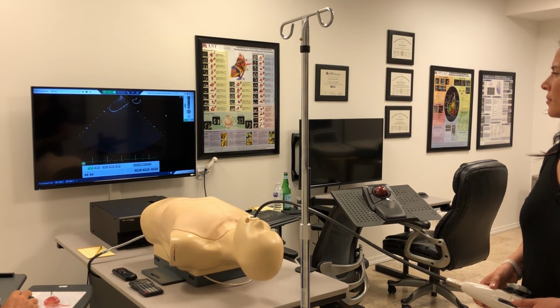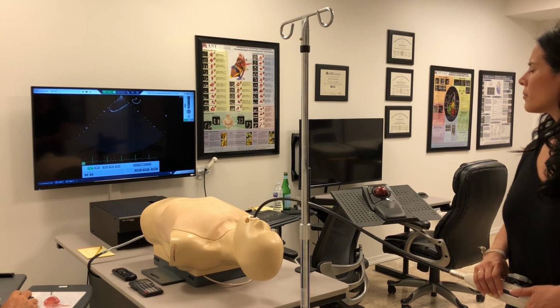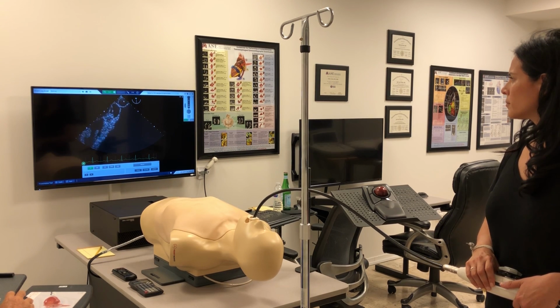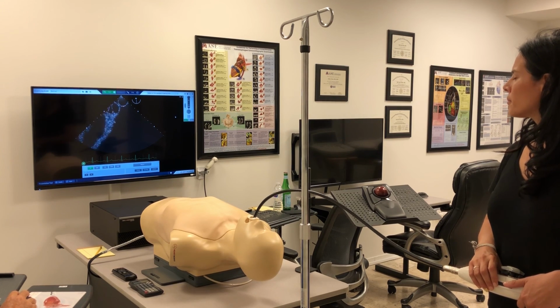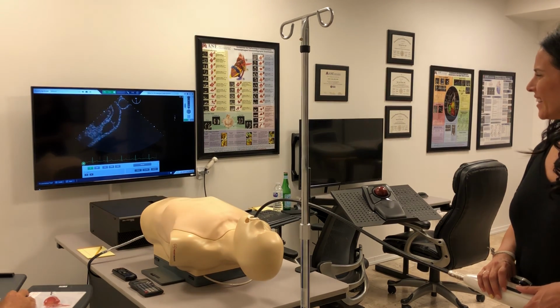Then the last view is just this view, but in short axis. So if we're at 0 degrees for this view, then to get the short axis view, we'd simply change from 0 to 90 degrees. Good. Now we see at the top of the screen, that's the aortic arch in short axis. And to clarify the view, to make it complete, we want to rotate the probe so that we strike an insonation plane through the pulmonic valve in the RVOT, right there. Beautiful. So that completes the exam. Very nicely done. Very, very nice. Good.